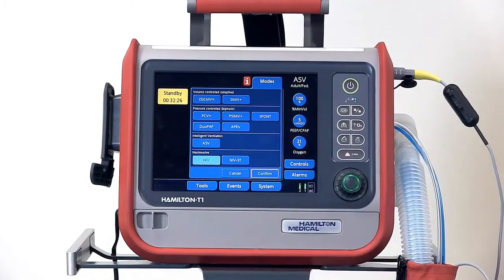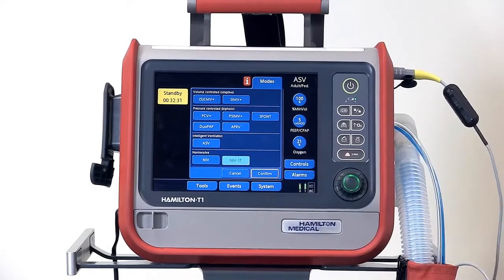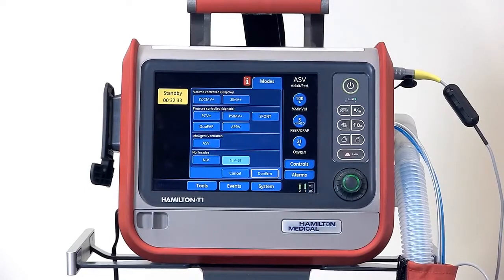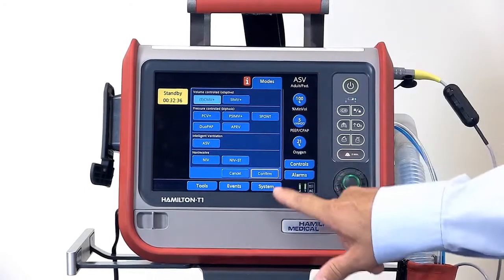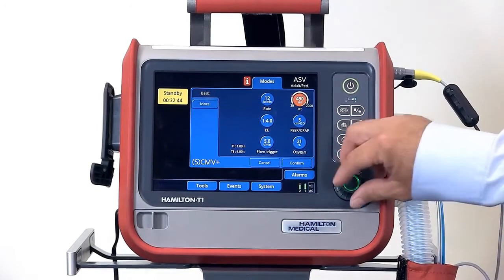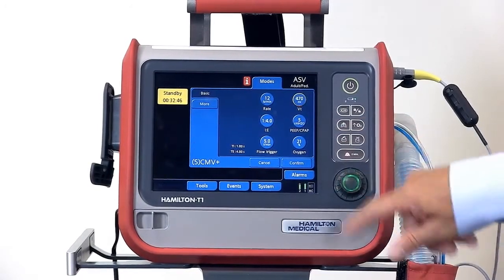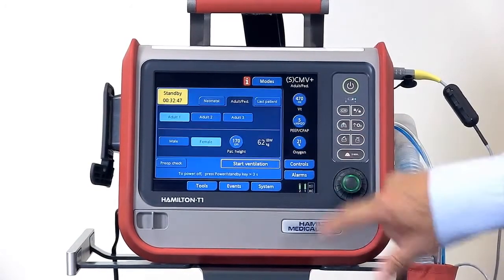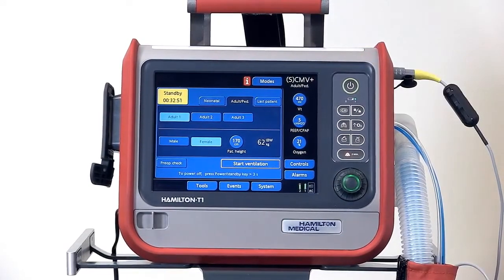In the bottom section are the non-invasive modes: NIV, or non-invasive ventilation, and non-invasive spontaneous timed ventilation. Select your mode and select confirm. This opens the controls window where you can put in the settings for each mode. Confirm the modes and settings, and you can see we've now changed modes.